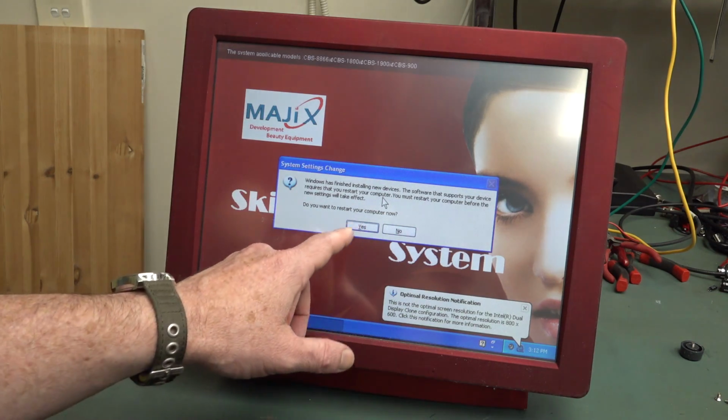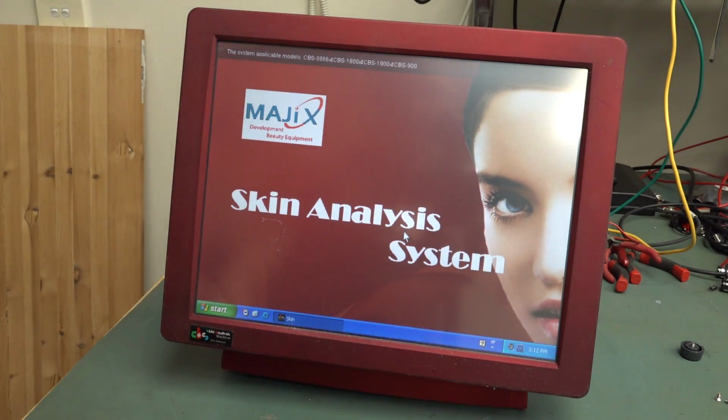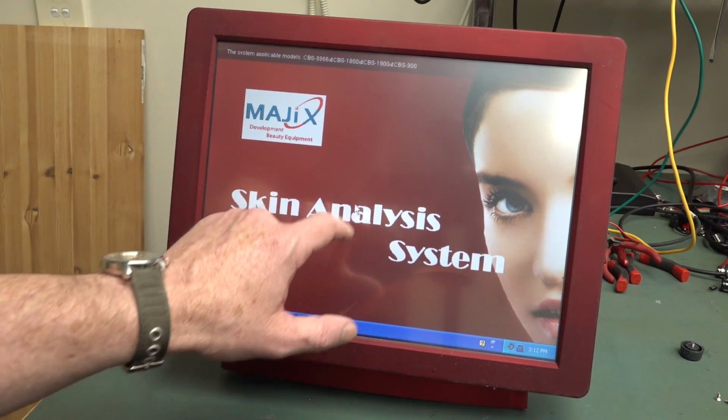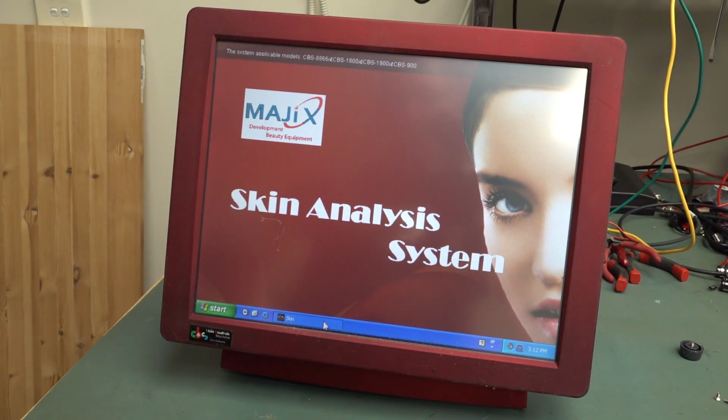Windows is fine. Installing new. Do you want to restart? No, it's obviously automatically detected it. And that resolution notice is really annoying. Skin analysis system. What do? Do we just wait longer or do we double click? What do? Now, what's happening, my guess would be, is that it's possibly locked up because we don't have the external camera.